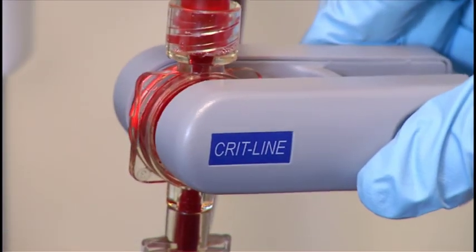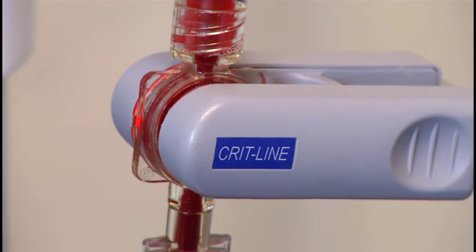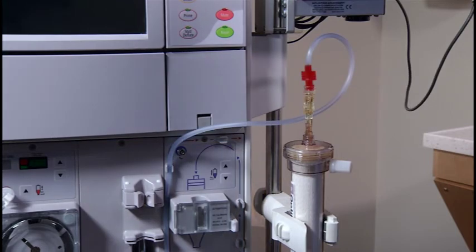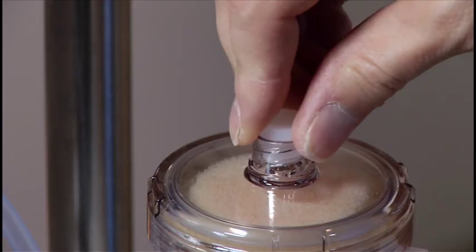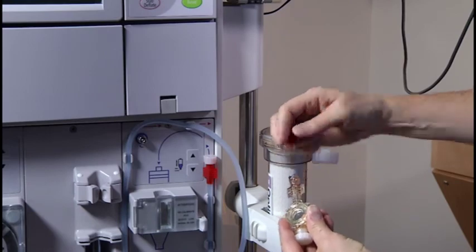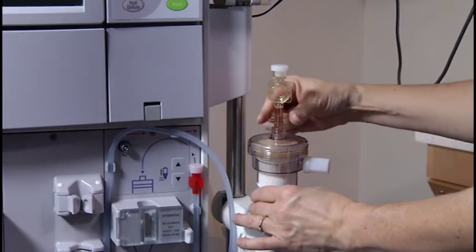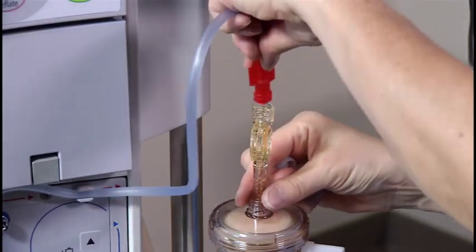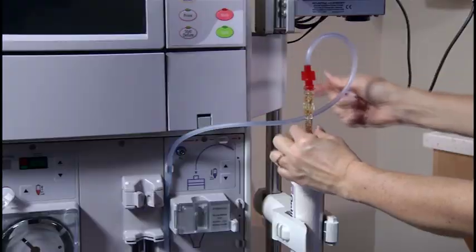The CRITLINE monitor uses a sensor clip which is placed on the blood chamber that is attached to the hemodialyzer. Proper alignment of the blood chamber and placement of the sensor clip is essential to obtain accurate readings. During setup of the extracorporeal circuit, attach the CRITLINE blood chamber to the dialyzer. Simply remove the cap from the arterial header of the dialyzer and the red cap from the blood chamber. Attach the blood chamber by twisting the wing closest to the header until the connection is tight without using excessive force. Then attach the arterial bloodline.